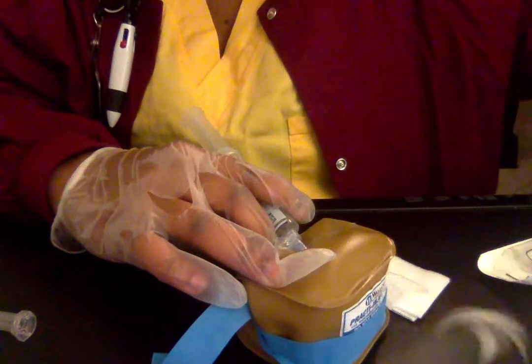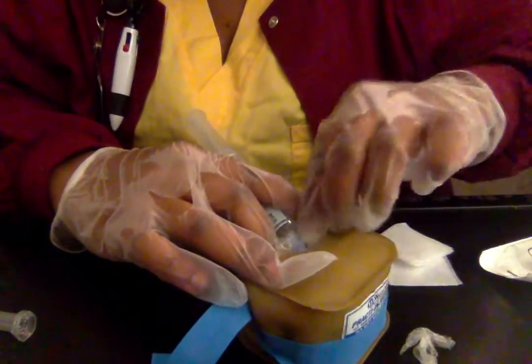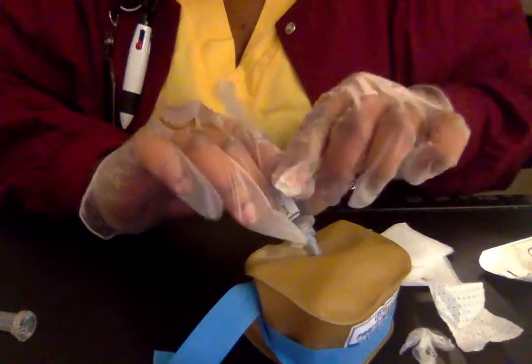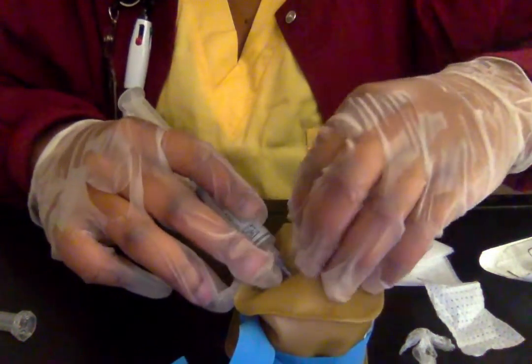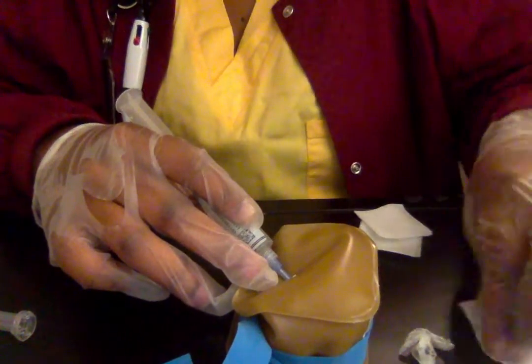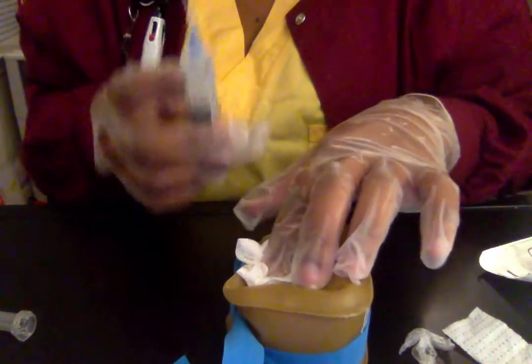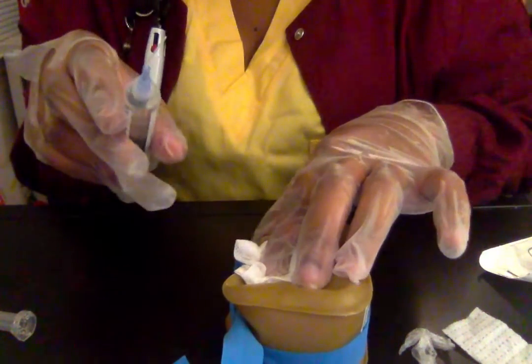Now that I've got that off, I'm going to take some more alcohol to get the tape off that's around the hub, that's just keeping it steady. Now lastly, what I would do is take my gauze on top of that and pull my catheter out. Here we can see that the catheter is a little bent, but it is still intact. There's no missing pieces.